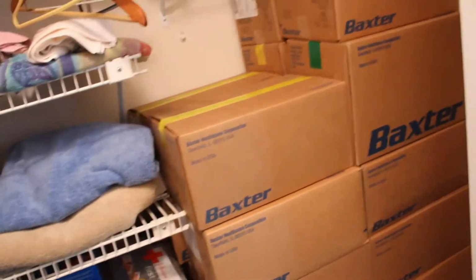And again, this is actually one of two closets that I have that are essentially filled up with Baxter boxes, and I go through almost all of them every month. Some of them are extras just in case there's an issue, because I have to have a week's supply essentially put aside in case there's a hurricane. But other than that, that's pretty much it.